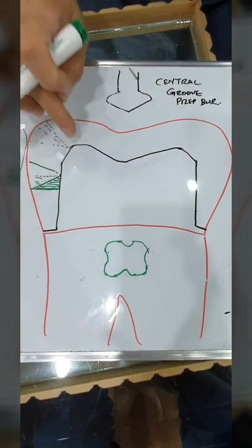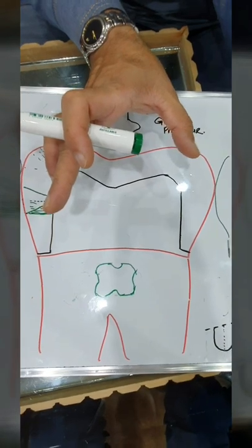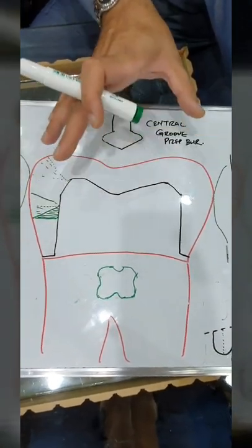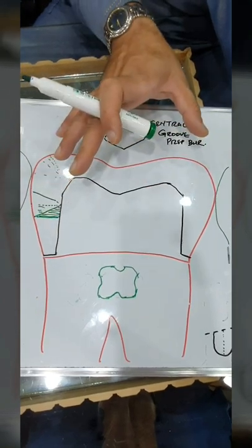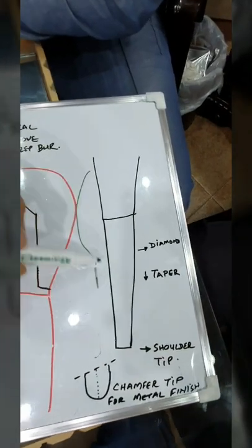But if you have the parallelism in the wall with very little bit of convergence, then you also have resistance added to the crown, so it won't slide off and it won't slip off. But coming back to the exact margin and the burr, the taper is built into the burr.